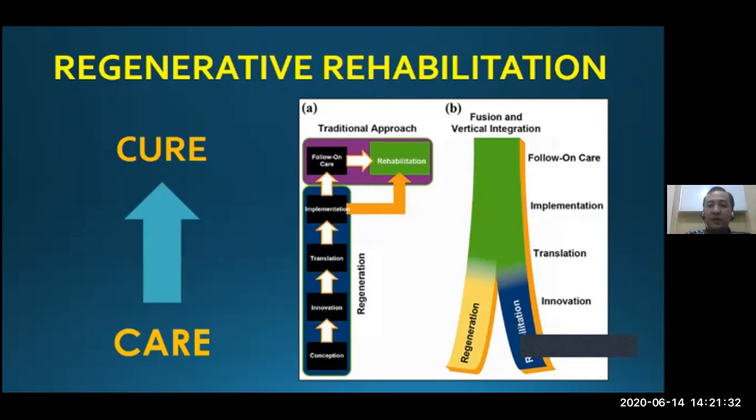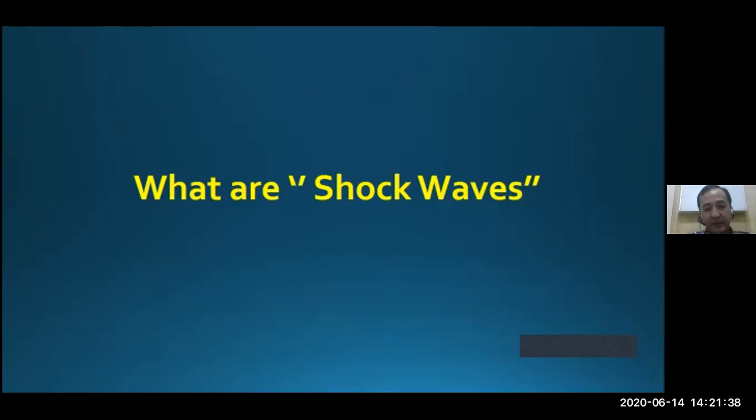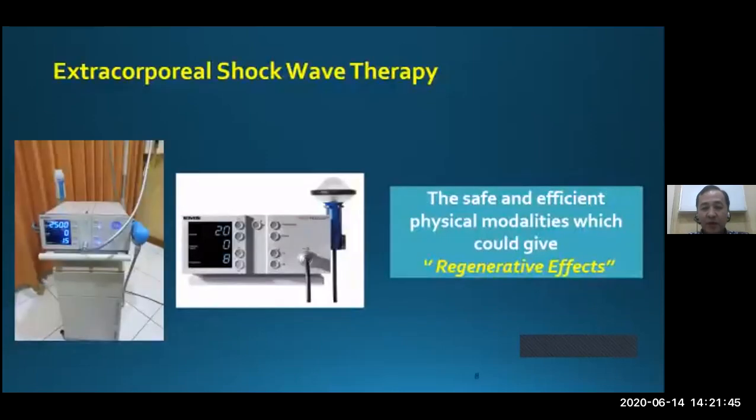So now, what is shockwave? I believe all of you already know about shockwave, just to remind and share my experience here. We know that extracorporeal shockwave therapy is one of the physical medicine and rehabilitation modalities which is safe, efficient, and can give regenerative effects, not only pain relief.